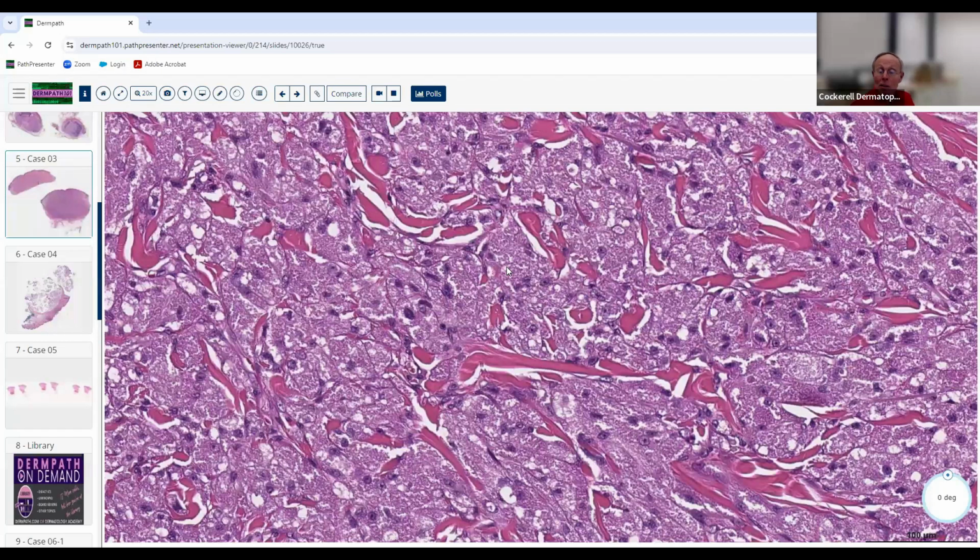Good. And it is a type of epithelium in a way. This is what we call one of the neurocristopathies from the neural crest, which is a type of neuroectodermal epithelium. So when the cells differentiate more toward the spindle cell morphology, we say, well, I don't know which epithelium anymore. But if they have this kind of morphology, we say it's a neural crest type of epithelium. So it is quasi-epithelium, like you said, at low magnification. But it is a neural neoplasm, and it is Schwannian.